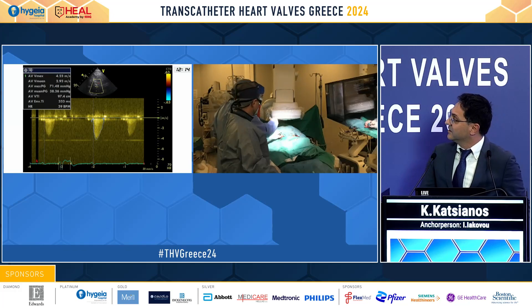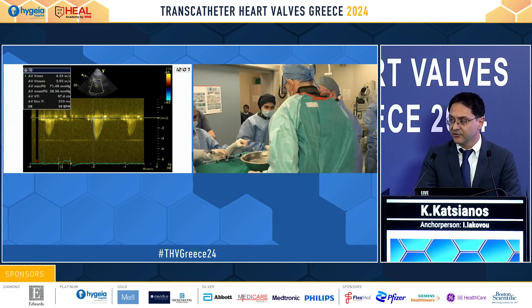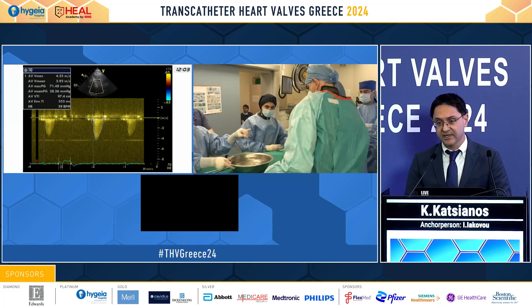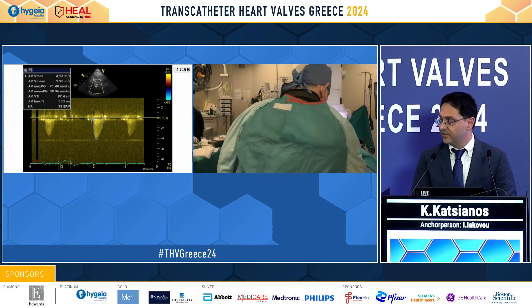It is important to notice that the Resilia valve has a dry tissue system. We need only two minutes to place the valve in the water infusion and it is ready. We don't need a longer preparation.